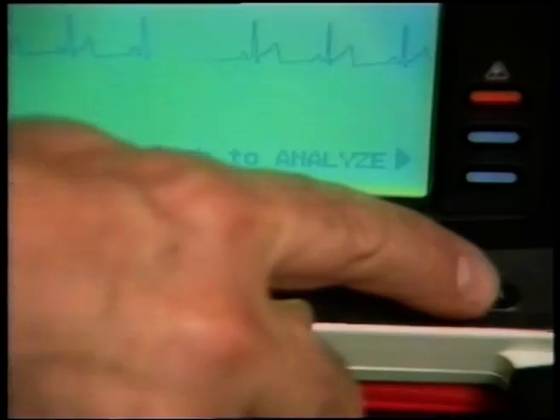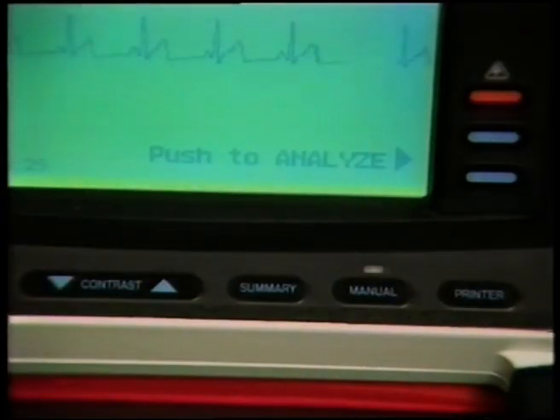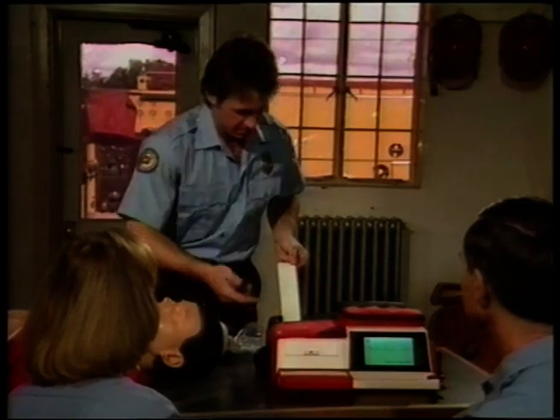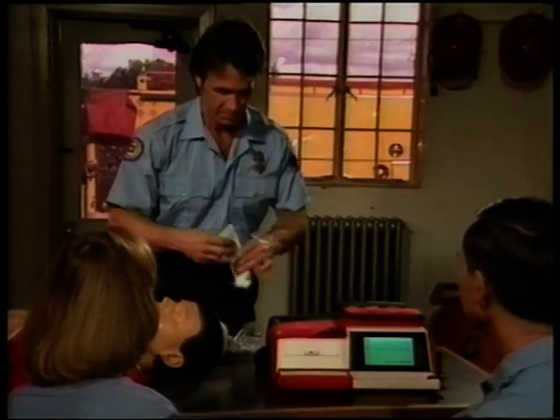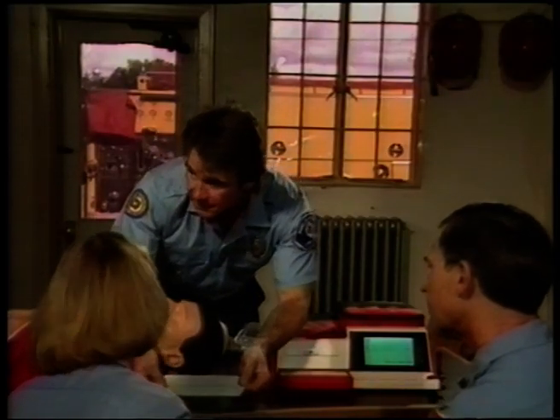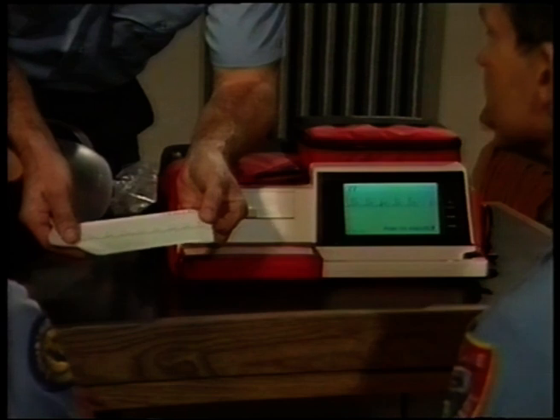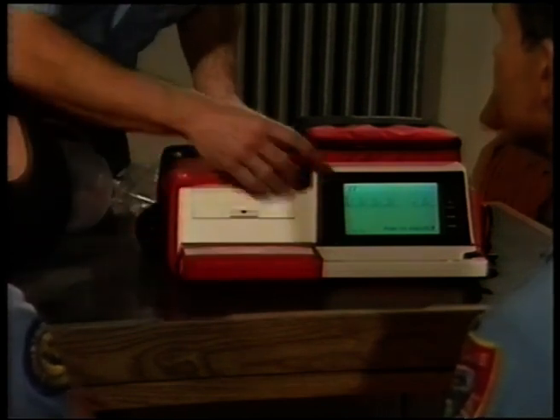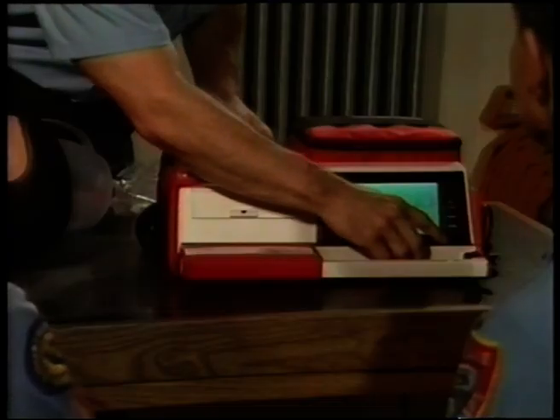In addition to the Code Summary documentation, you may want to record the patient's ECG during monitoring. To record, push the printer button. To stop the printer, push the printer button again. The printed ECG information is 5 seconds delayed from when it actually occurred in order to give you time to push the printer button. If your LIFEPAK 300 is not supplied with a printer, an event button appears in the place of the printer button.